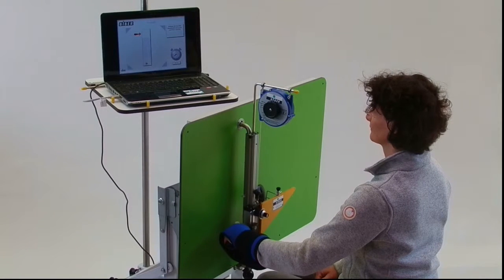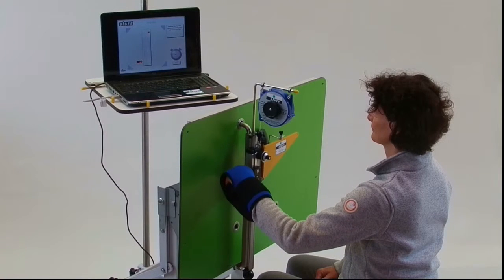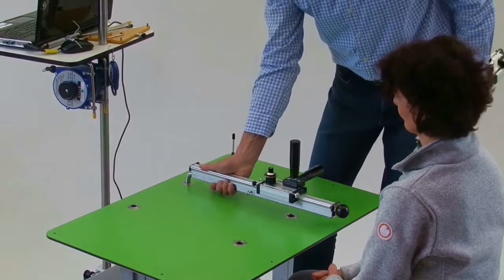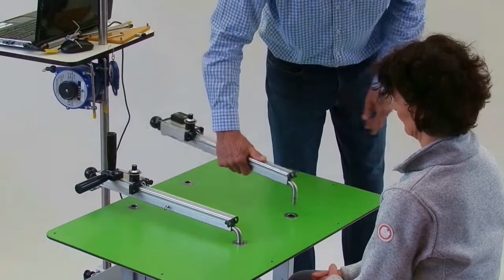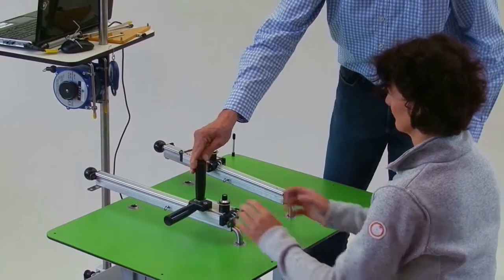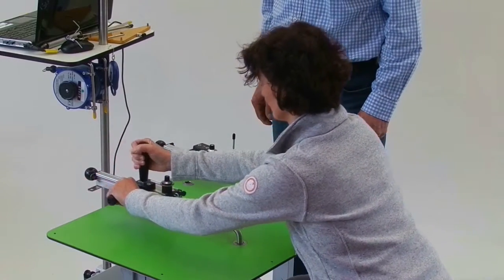Furthermore, one can see that the red ball in this software adjustment is moving very slowly, and the arms have to cover longer distances. Trunk movement can also be carried out if one rotates the swing arms and puts them into both of the front bore holes. Two handles can be screwed onto each swing arm.